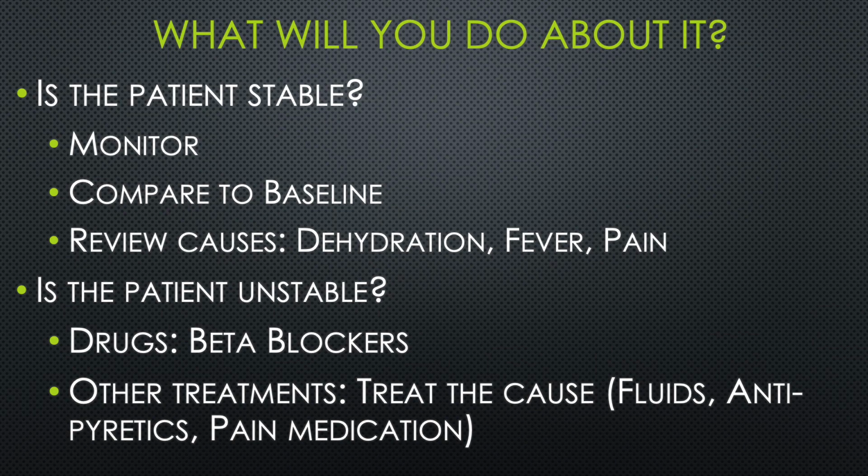If the patient's unstable, then we want to start looking at treating that rhythm. So we talked about in a slow rhythm how it's not good because you're not getting enough heartbeats to get enough blood out.